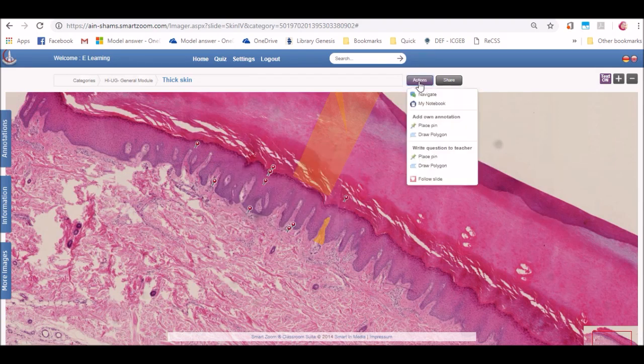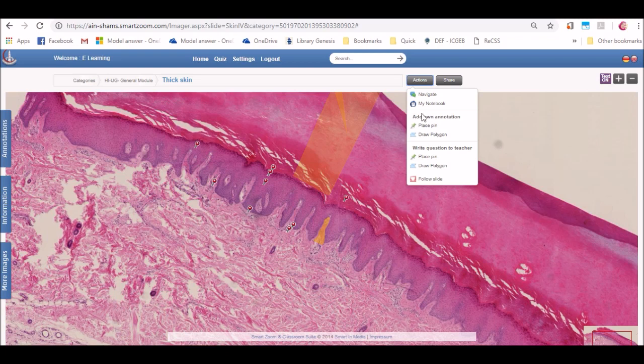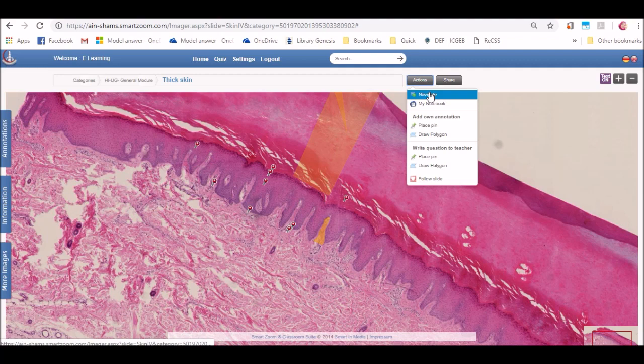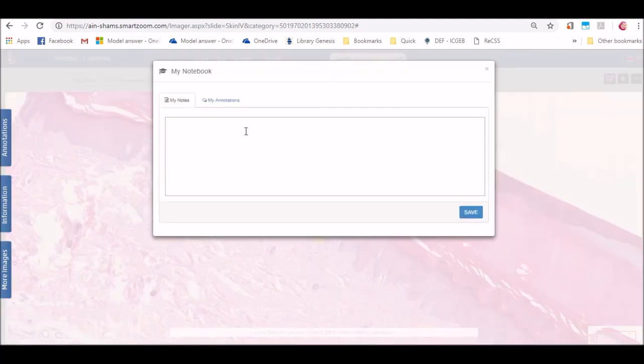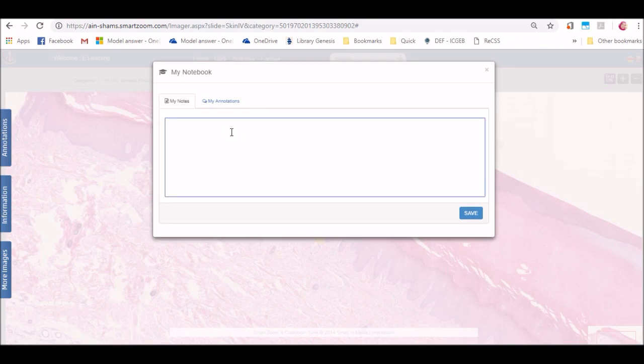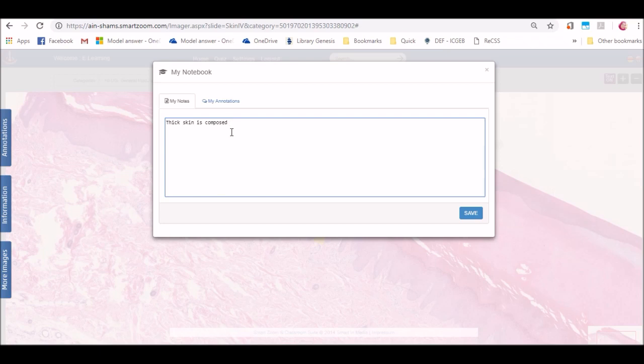Now, let's go through the features that we can use as users in this platform. By clicking on actions button on the top, you will find a drop down list of all the features that you can use as a user in this platform. First one is navigate. Navigation was what we were doing by zooming in and out and moving the slide and reading the annotations.